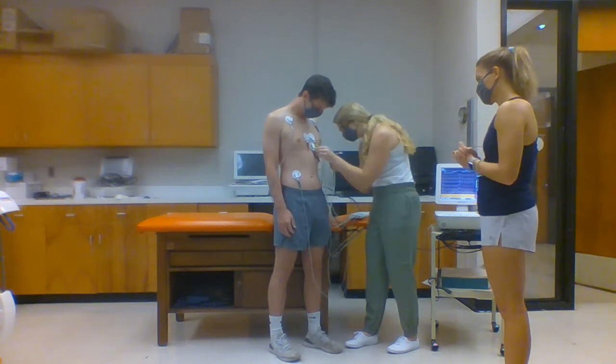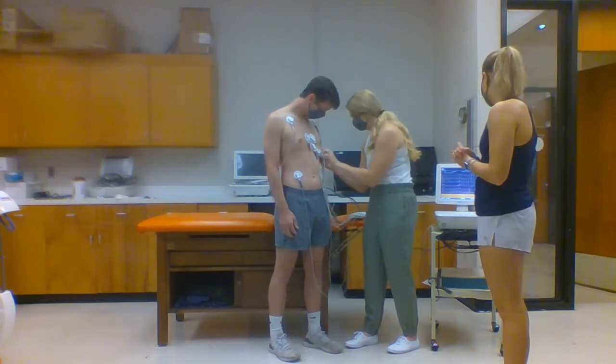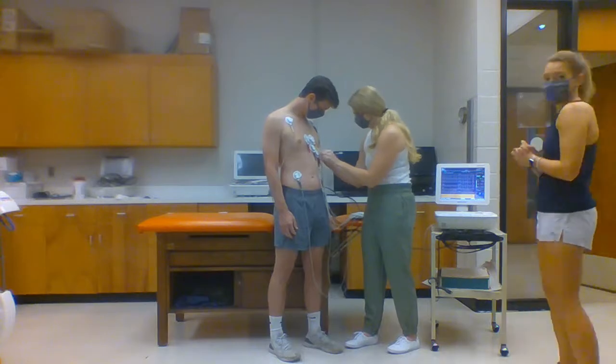We have now placed all 10 electrodes and connected all 10 wires. On the monitor, we will see 12 ECG tracings and are ready to view our subject's ECG. Now that we have successfully prepped the skin and prepped our subject for the ECG, all electrodes and wires are placed, we can now continue with the lab procedures.